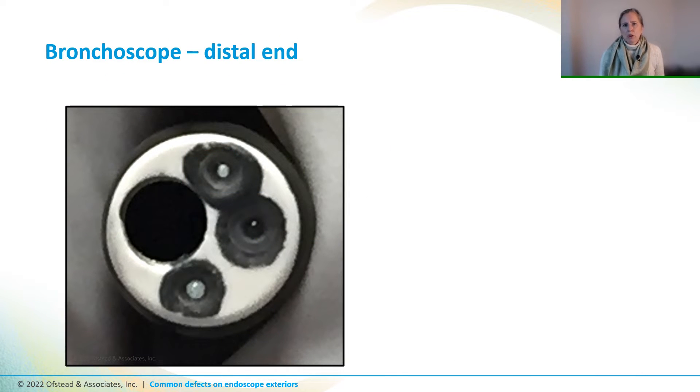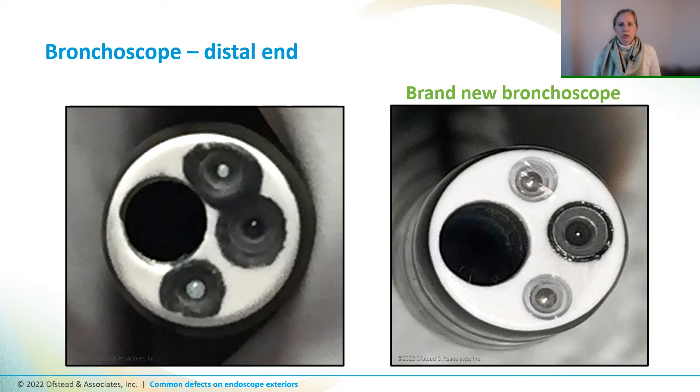The distal end of this bronchoscope looks really strange compared to the distal end of a brand new bronchoscope, and repair specialists said that the white distal end cap appeared to be damaged — it's possible someone had done a poor job of adhesive application when they tried to fix it.